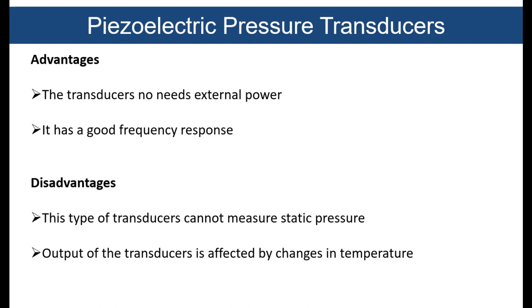The advantages of using this piezoelectric pressure transducer include a good frequency response, and this transducer does not need any kind of external power. It also has disadvantages: this type of transducer cannot measure static pressures. Definitely, because we need dynamic pressure to be applied to see the change in the signals we get in the form of electrical output from the crystals. That's why we have to use dynamic pressure here. We cannot use static pressure for the measurement.